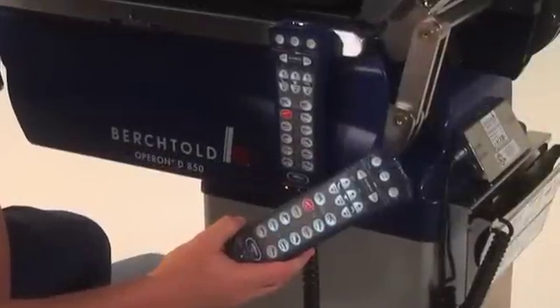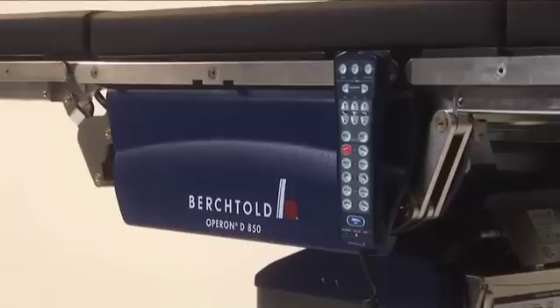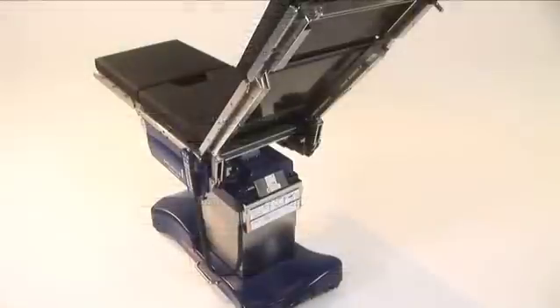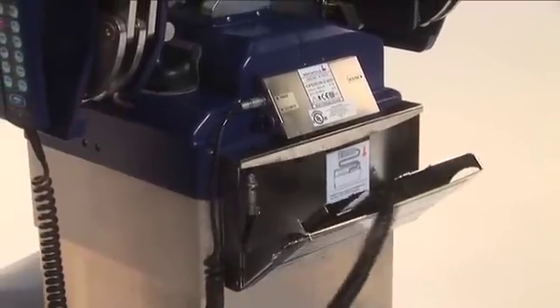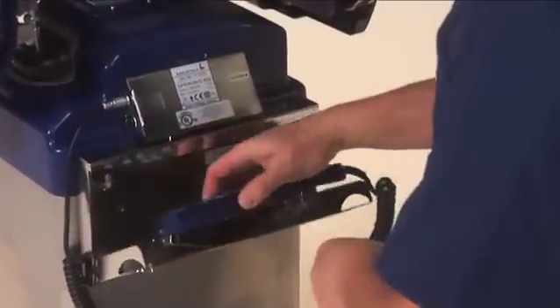Your D850 surgical table includes two identical hand pendants. One is the primary hand control, and a backup hand control is stored inside a storage box located beneath the back section. To open the box, swing the latch to the left to release the box door. In the event the primary hand pendant is lost or damaged, simply attach the backup hand control to the pendant port.